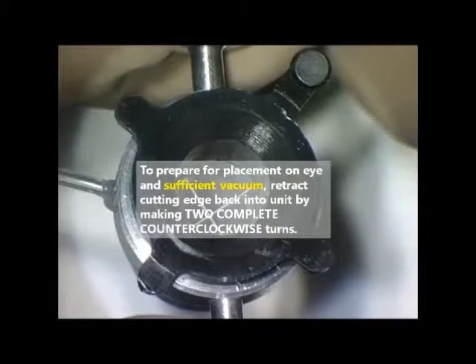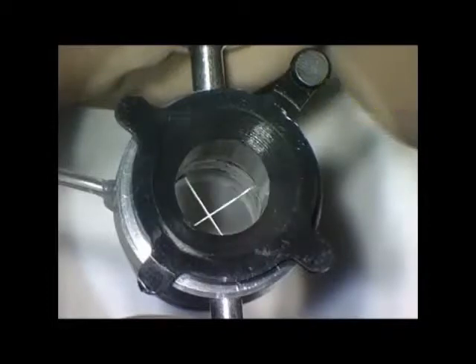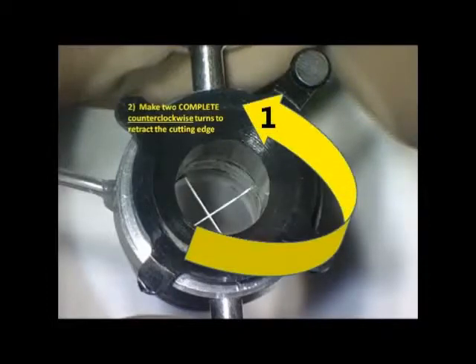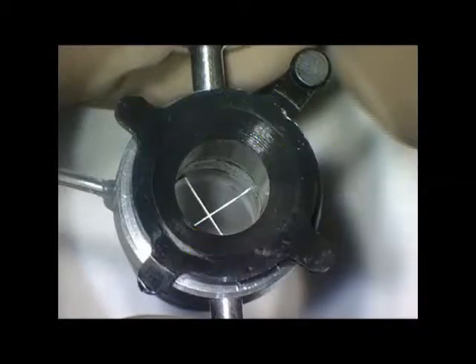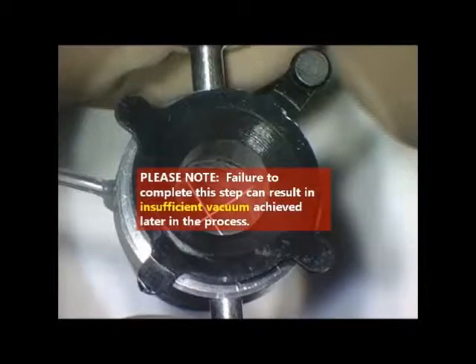To prepare for vacuum and eye placement, make two complete turns of the indicator pin counterclockwise. Now the cutting edge should be back inside. If this step is not followed, sufficient vacuum may not occur.